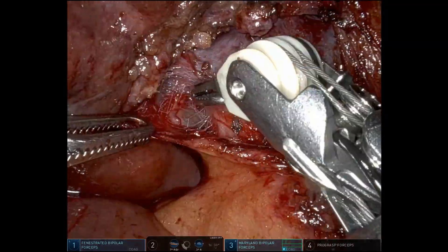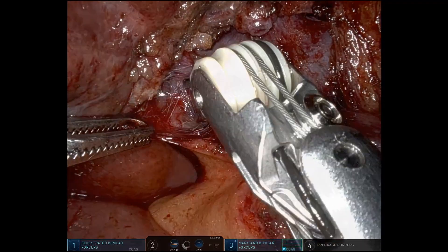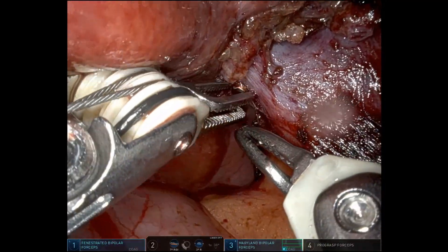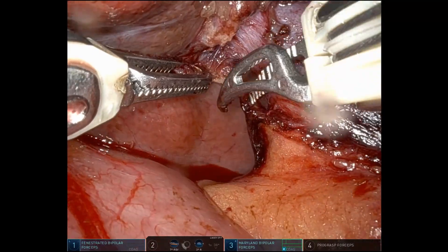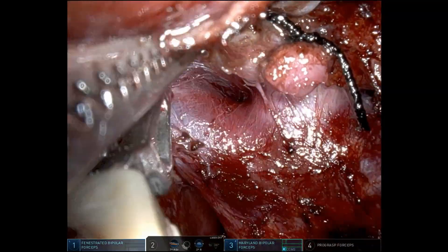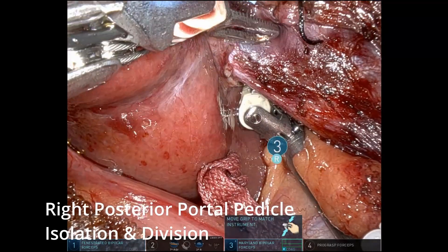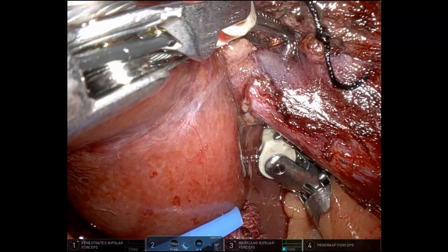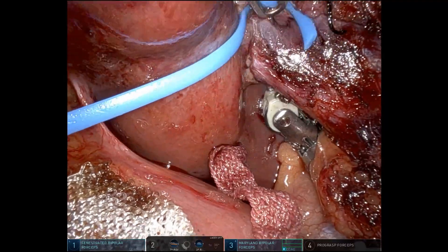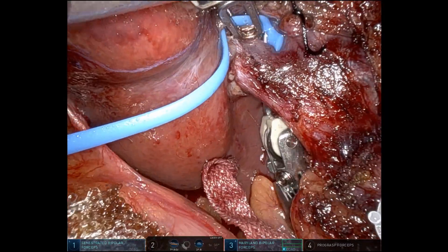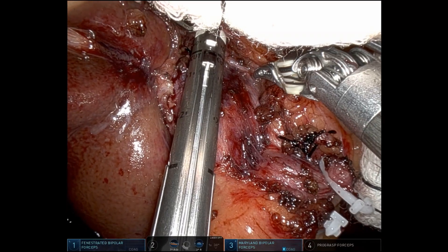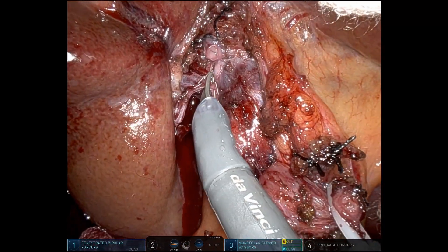Here we are with continued dissection to provide access to encircle the right posterior portal pedicle. We commonly use pinch burn technique with the Maryland bipolar. Dissecting out the crotch — the space between the right anterior and the right posterior. Here you'll see that we encircle this with a vessel loop. Typically when you have type one or normal portal venous anatomy, we will control the right portal vein with silk ties and weck clips. Here the space was very limited, so we decided it would be better to divide this with a vascular stapler. There was space to get a small Signia stapler in there with a white load. So there the right posterior portal pedicle has been divided.